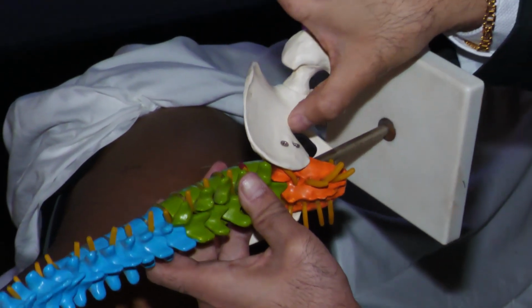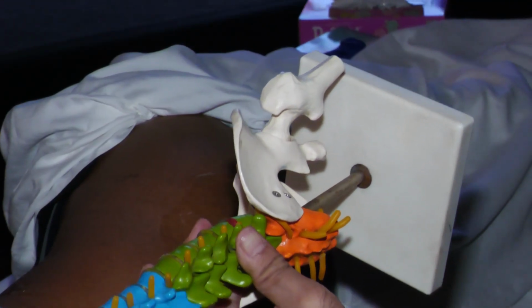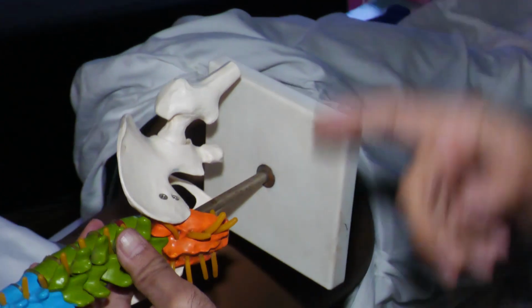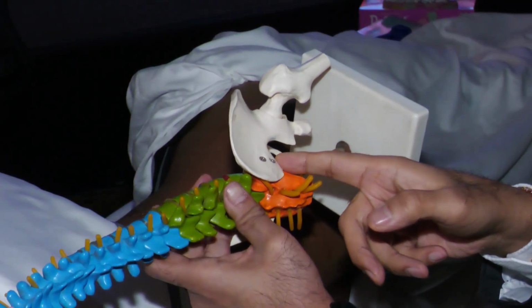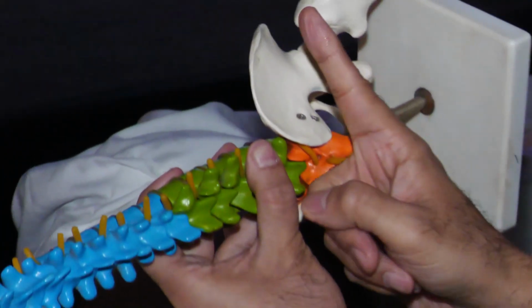The lateral boundary of the greater sciatic notch, my dear friends, is the PBI, posterior border of the ischium, which has got a parrot beak appearance. Is it clear? The medial border articulates with the sacrum, so it is a part of ilium. Alternatively, the highest point of the gluteal cleft, my dear friends, is visible to everyone. Just take 8 centimeters from that. You place your probe like this.